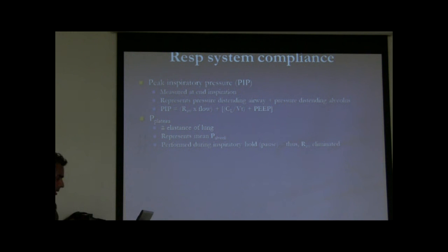So on the ventilator itself, you push this thing called the inspiratory pause. Once the breath comes in, there's a pause. You wait for a second, and you'll see a dip on the monitor. So you have the PEEP, the breath comes in, you hit the inspiratory pause, there's a little dip, and then it's a plateau, meaning it's flat. That's why they call it plateau pressure. Then you let go of the inspiratory pause, and it drops back to your PEEP.